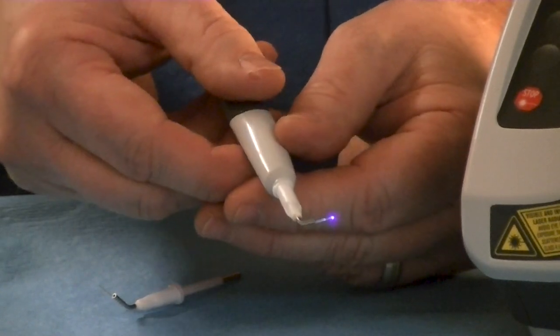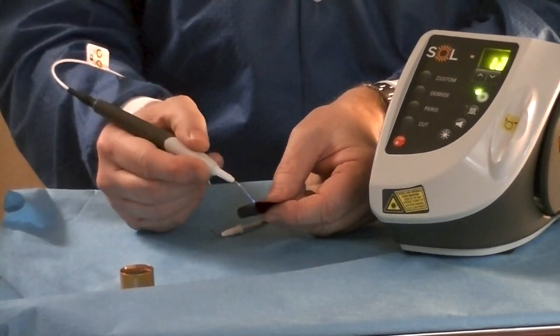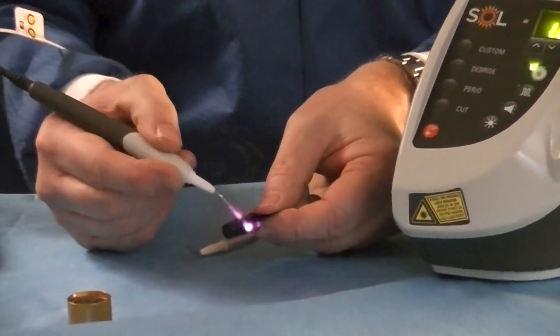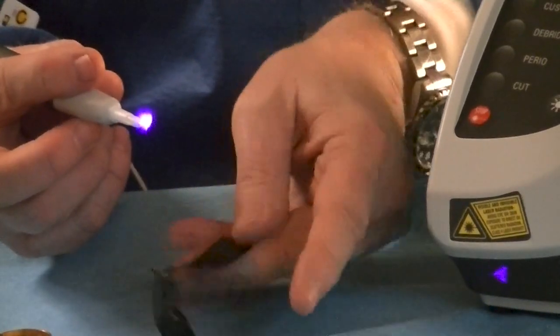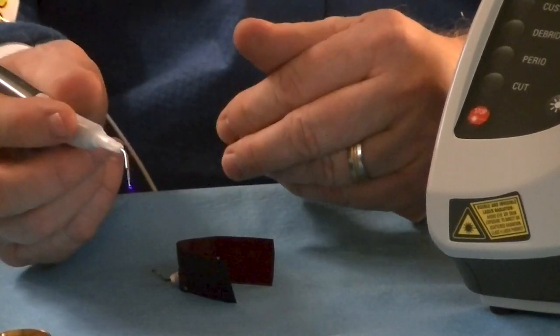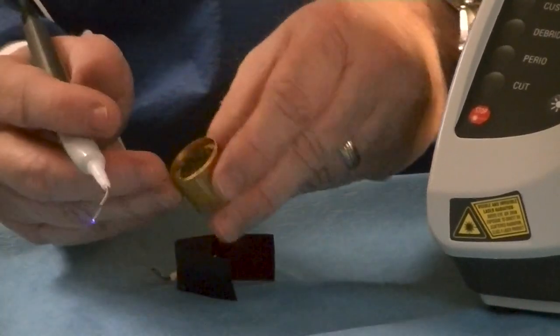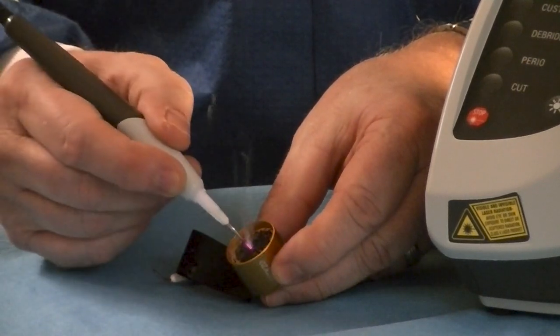To activate the tip, you'll take some occlusal paper and can simply run it — you can see it smoking up. That will just char the tip so that it now becomes a cutting tip. We don't do that with Perio. Or if you prefer, you can use cork and char it that way.